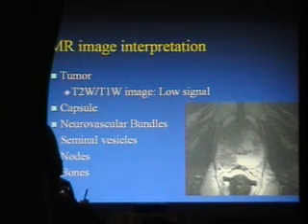And then after that, you stage the lesion. You want to go through your staging algorithm, and every report should talk about whether the capsule's involved or not, whether the neurovascular bundles are invaded, seminal vesicles, nodes, and bones. If you put all of these in the report, you'll keep those surgeons and radiation oncologists happy. The other critical thing, again, just like in the cervix, is to measure the volume. They really need to know the volume. The prostate volumes can range from 30 cc's to 200 cc's.